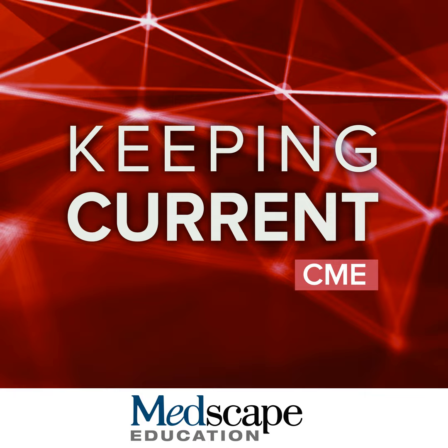And actually, in most cases, the neurodegeneration, the atrophy that we see on the volumetric MRI or the drop in metabolism on an FDG PET scan, is at that end stage of the disease. And so which test you're getting to begin with also depends upon which stage of the disease the patient is that you're thinking about. Okay, so very, very common question that comes to our reading rooms all the time is, what test should I order first?